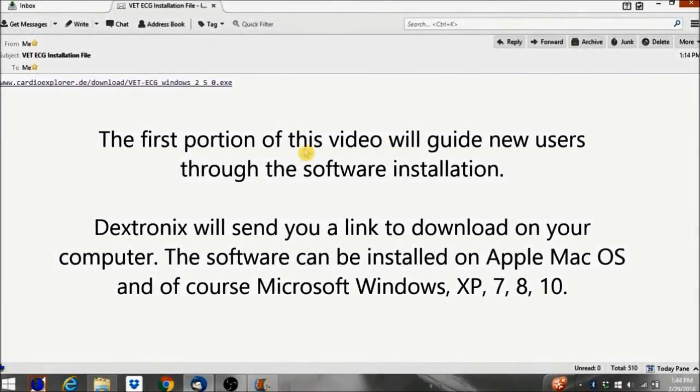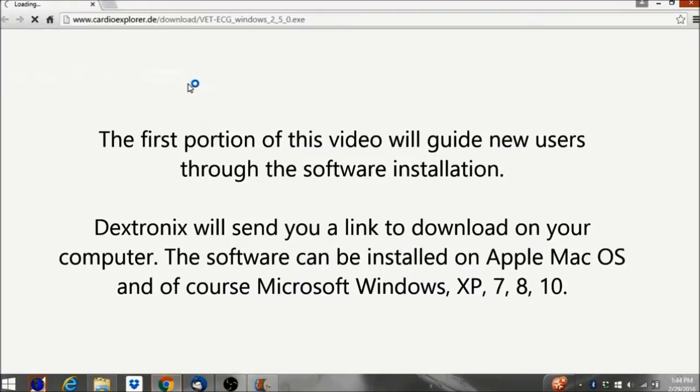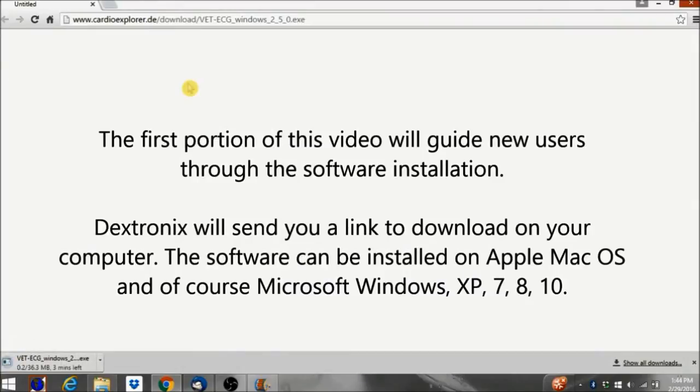The first portion of this video will guide new users through the software installation. Dextronics will send you a link to download on your computer. The software can be installed on Apple Mac OS and of course Microsoft Windows XP, 7, 8, and 10.